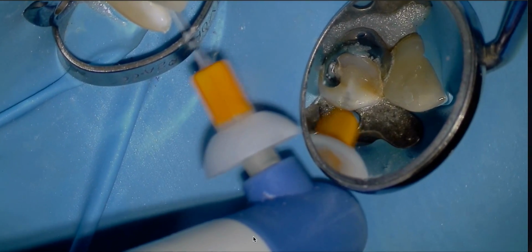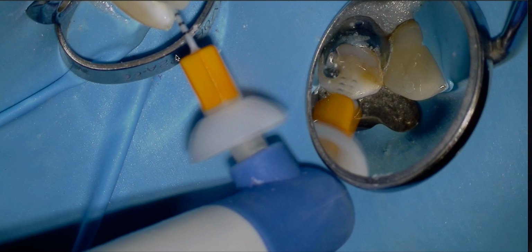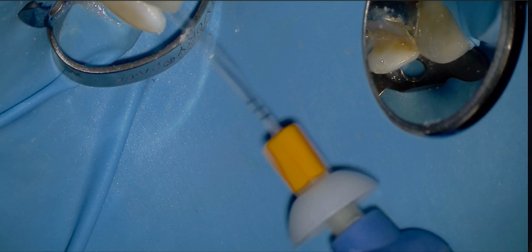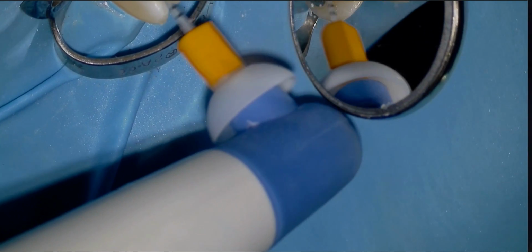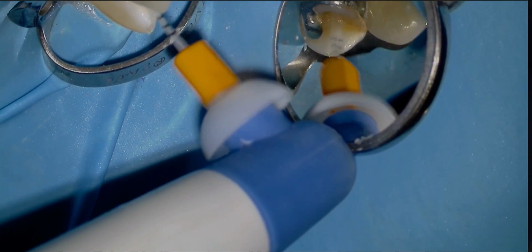And then I'm a huge believer in ultrasonic or sonic. It's really simple. Unfortunately, I'm not getting paid by Dentsply. I wish I was, but I'm not. But I use the activator, and this sonic device is simple. The reason why I love it is because these are cheap, and it's really tough to break those nylon tips. There's the EDDY from VDW. I'm going to be trying that out down the road. That's another great opportunity, another simple technique to use. So I'm going to do sonication in both palatal and buccal canals.